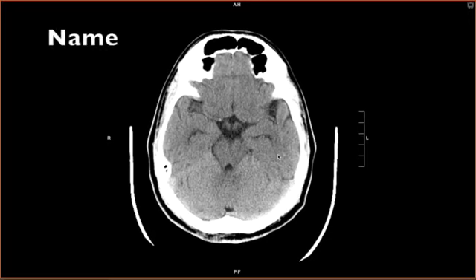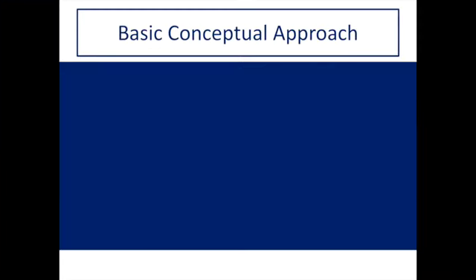You can also go to headneckbrainspine.com where you can practice scrolling through images and identifying basic anatomy. When you first start, the best way to approach a CT head is by thinking of things conceptually, based on the things that you never want to miss.